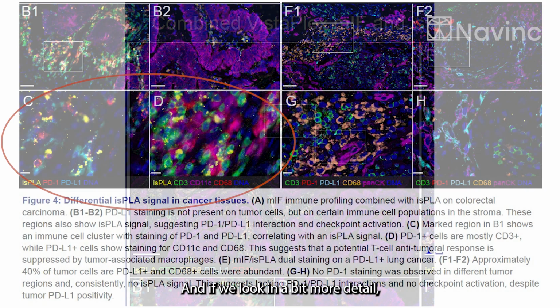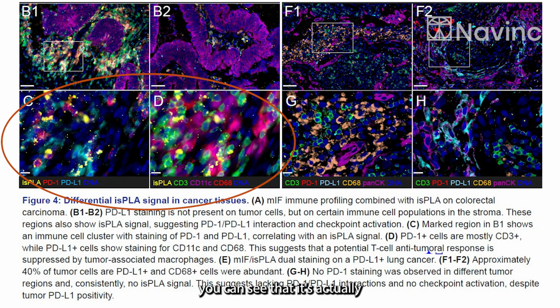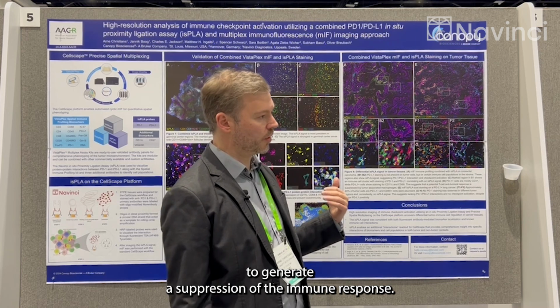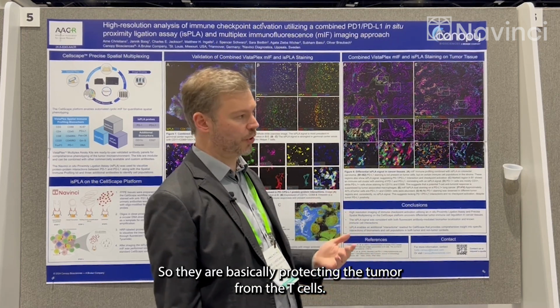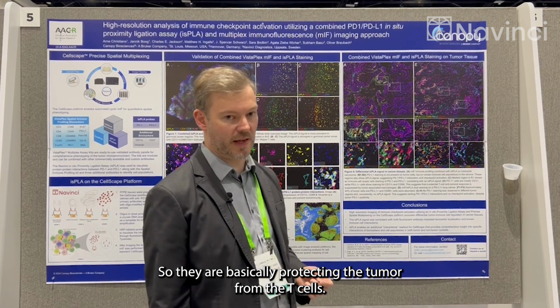And if we look in a bit more detail, you can see that it's actually tumor-associated macrophages that are interacting with T cells to generate a suppression of the immune response. So they are basically protecting the tumor from the T cells.